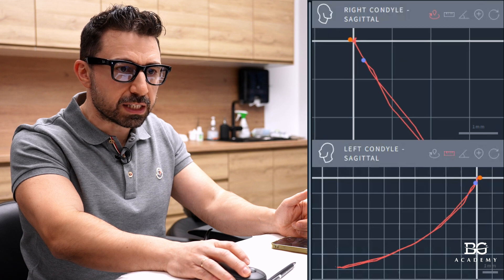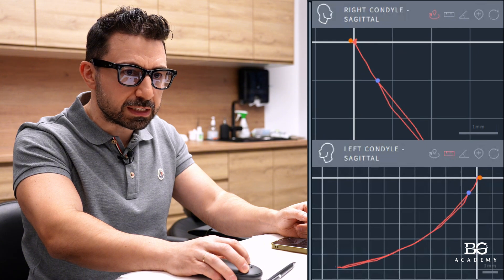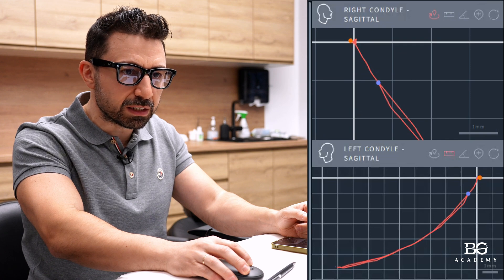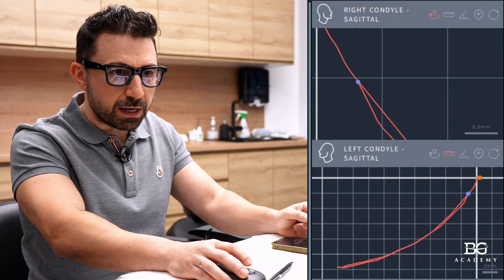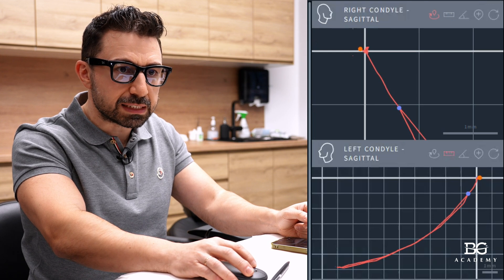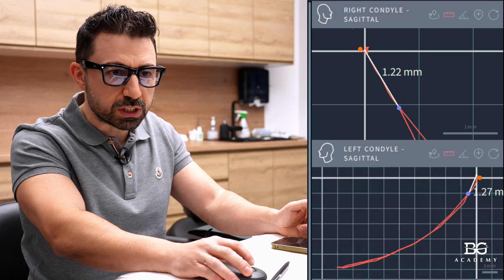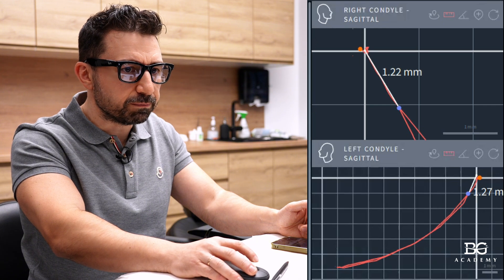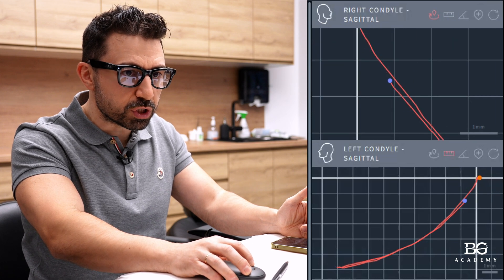How can we use this data to test the position? I would like to keep my tracing just before this cross — just before this area — because I assume that in this moment her condyle still stands on the disc. I'll mark it there. Then we can measure how much protrusion gives us a position where we are still on the disc. In our case it's around one and a half to two millimeters. She has the click mainly on the right condyle, and we can get this position for our dental technician for making our splint.